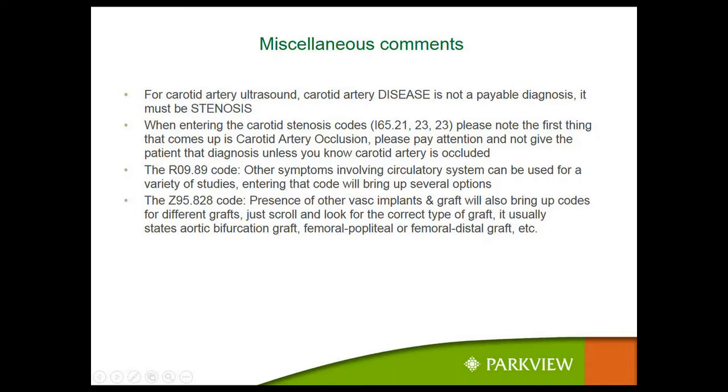And a difference between radiology, and I don't know how many of you know this, radiology vascular ultrasound and cardiology vascular ultrasound. Not only do our cardiologists read our vascular ultrasounds, but we have a totally different diagnostic criteria. So what they say is 60%, many times our diagnostic criteria would say it's 25%. Wow. And that's a dream of mine, to get one diagnostic criteria for all of Parkview vascular ultrasound. Why is it that way? Because radiology uses their own diagnostic criteria under the radiology code.